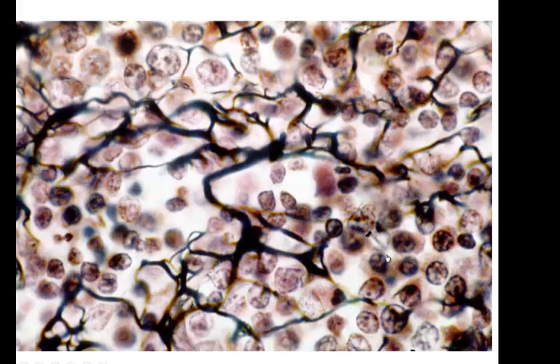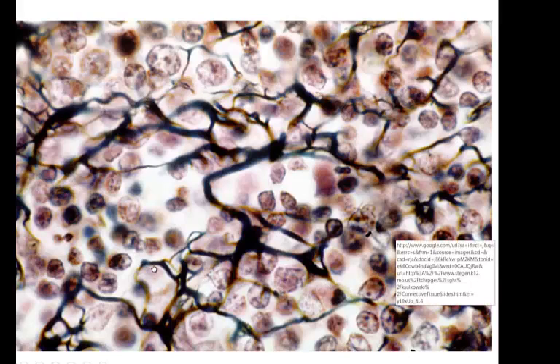And so what reticulum means, or reticular means, these reticular fibers, like I said, this means a network. And so what these reticular fibers are doing, they're forming a little skeleton, a little network to support these cells. So these cells have a nice stroma background for them to reside upon.